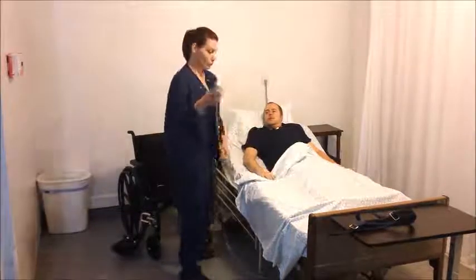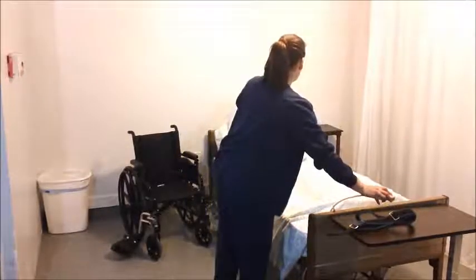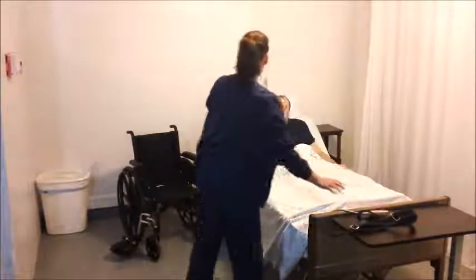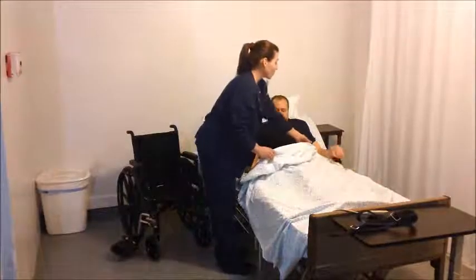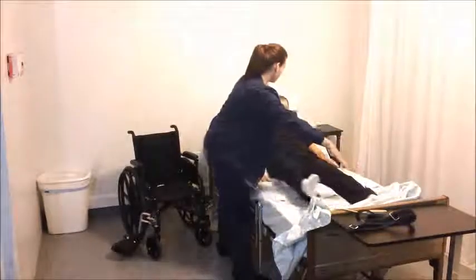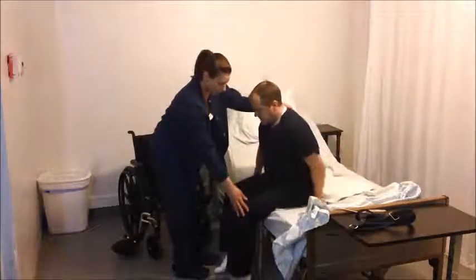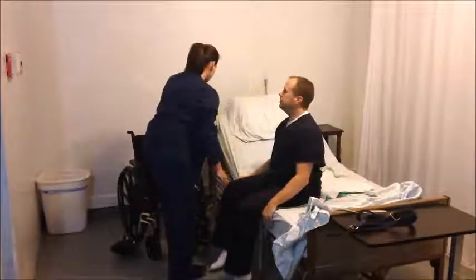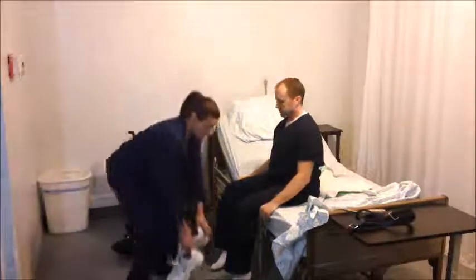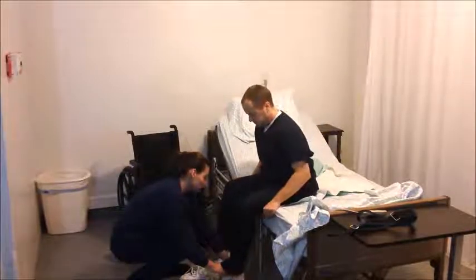Raise the bed to a safe, comfortable level. Provide support to assist the client to a sitting position on the side of the bed without pulling the client by lower arms or hands. Place non-skid footwear on the client and allow them time to sit on the side of the bed to adjust to the change in position before beginning the transfer.